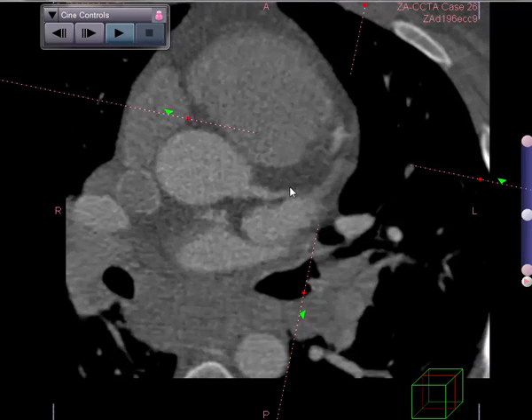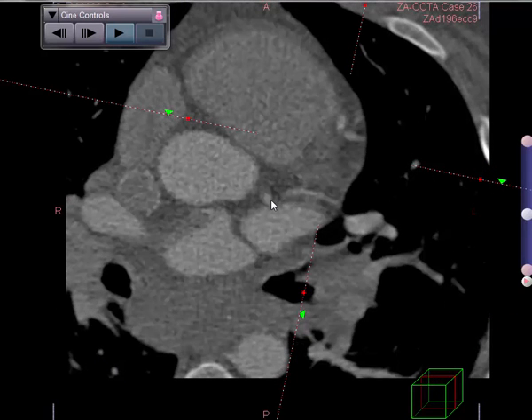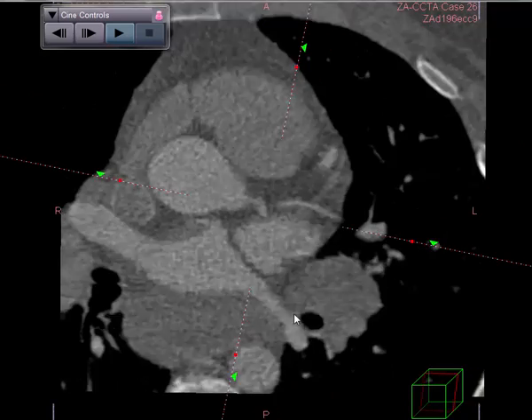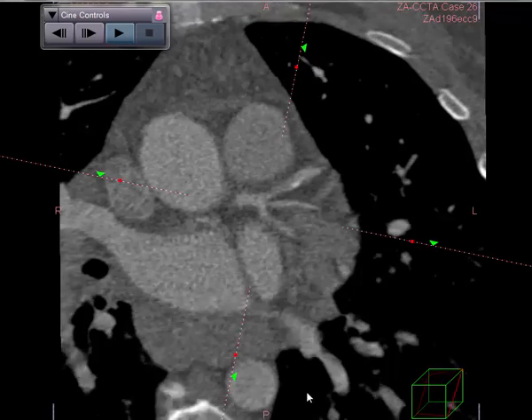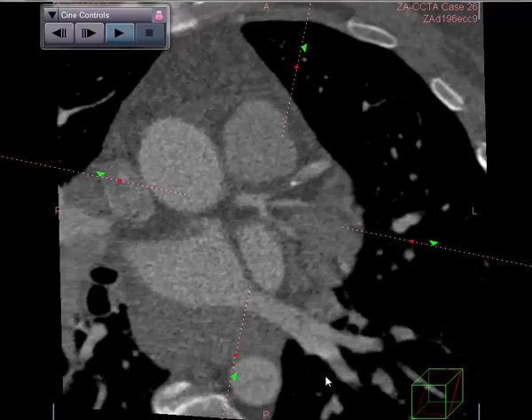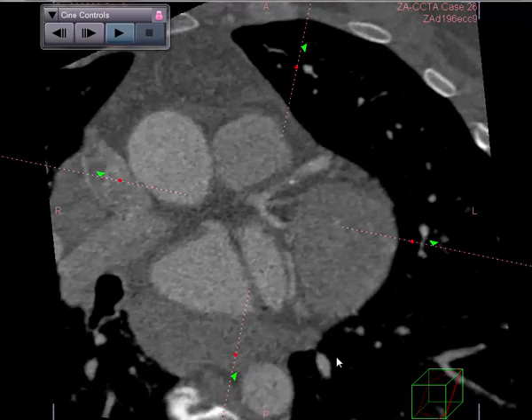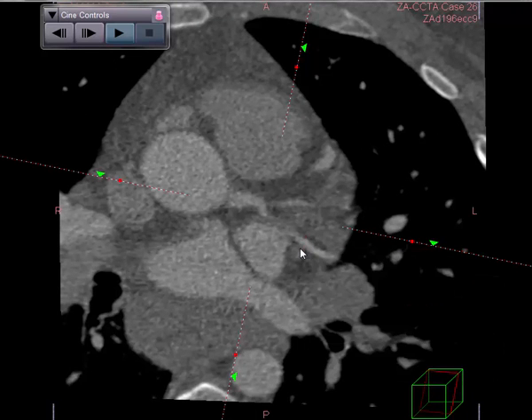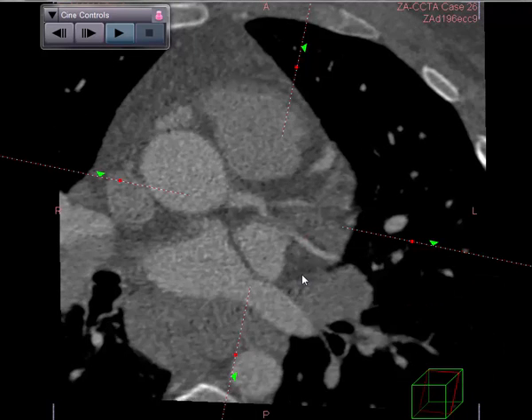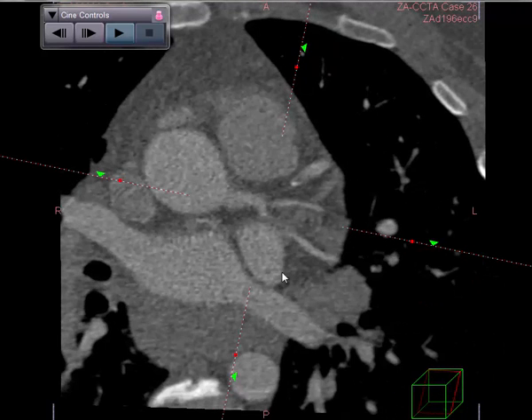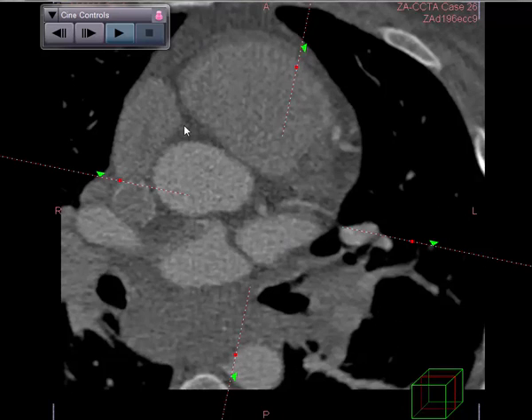Let's take a look at the circumflex vessel. It comes off about here. We can proceed down to look at this very small vessel — a normal OM branch here. The rest of the vessel appears to be frankly normal.